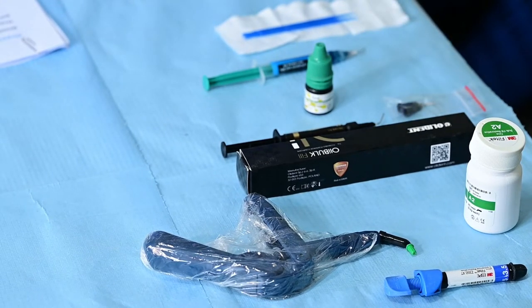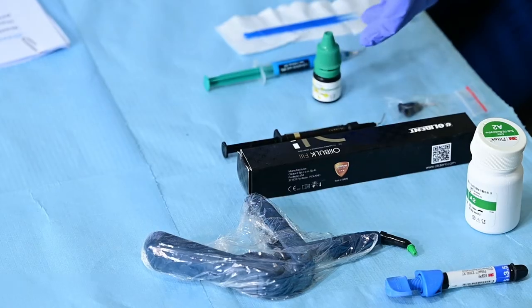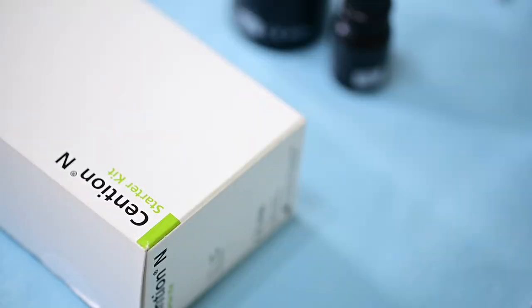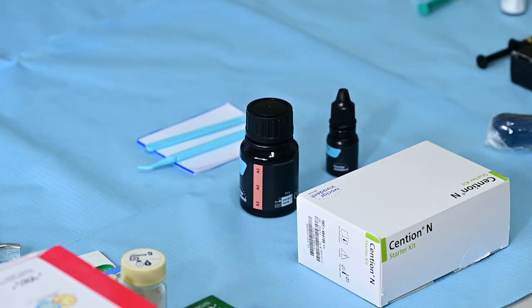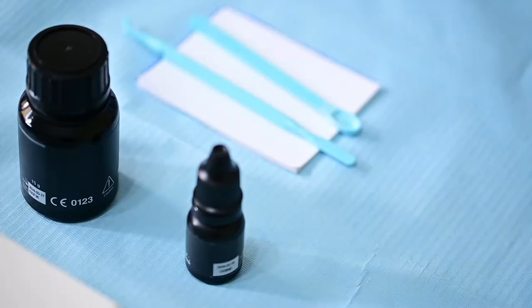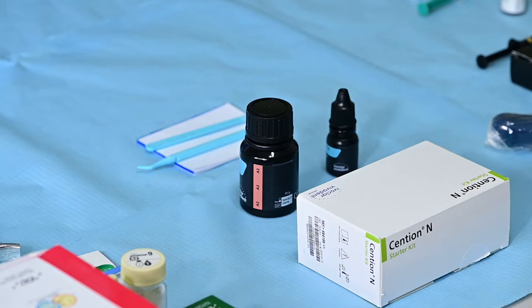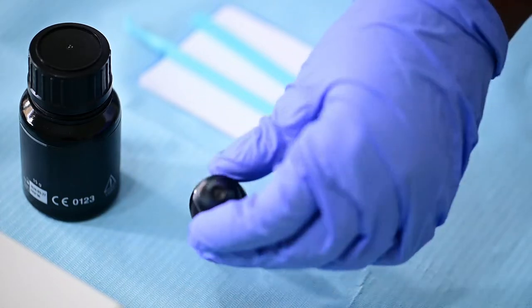As you can see it has a tip for dispensing this material. Then our commonly used bonding agent. After we have manipulated the bulk fill resin composite we will proceed and now handle Cention N. Cention N as we have learned in the lectures is actually a resin composite but then the fillers are alkaline. So it's an alkaline filled resin composite. Cention N was the first and the most used alkaline filled resin composite and so we are going to be manipulating it.